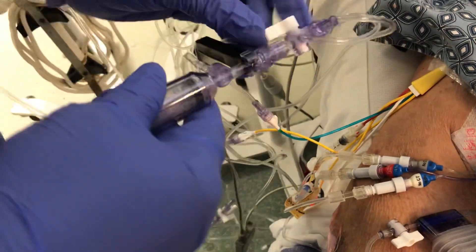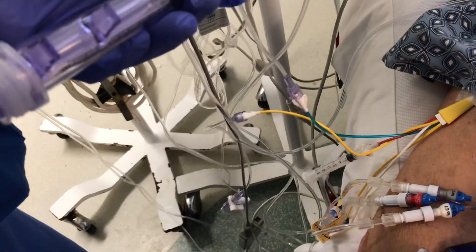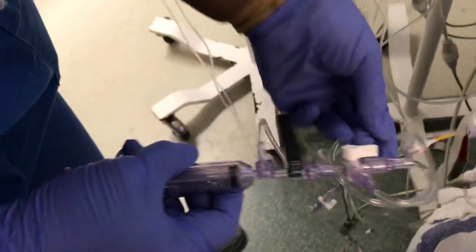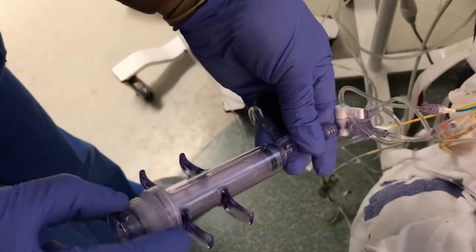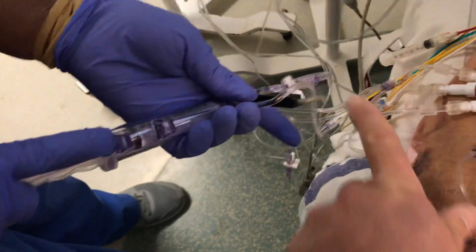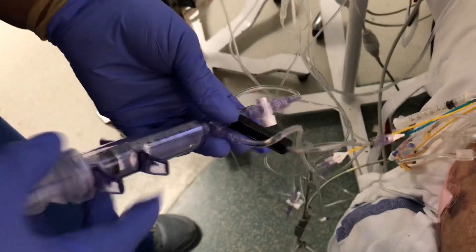So that says maybe you can ask them about that. You're going to turn it off to your CVP monitor. And that's my line right there. Because that's the injectate port — could go inside there. Pulling out 10 cc's. So the D5 is in this one. The proximal injectate for the cardiac output.